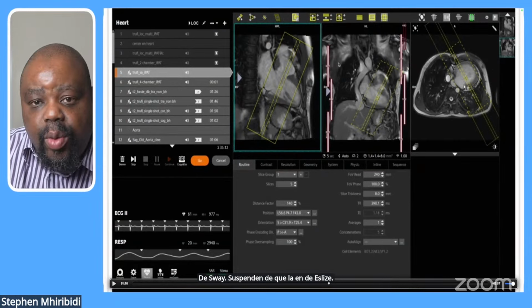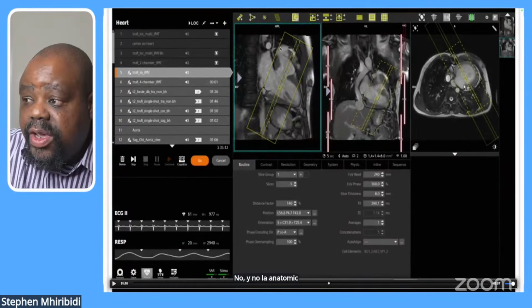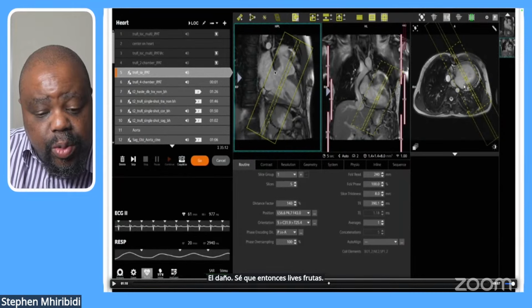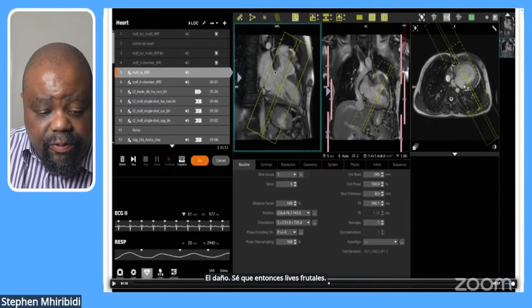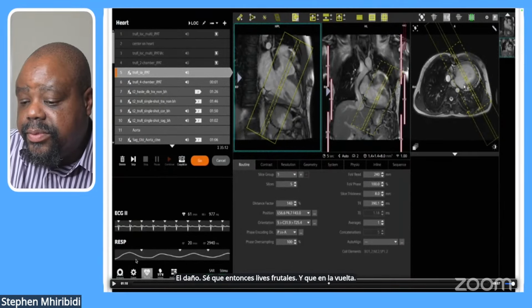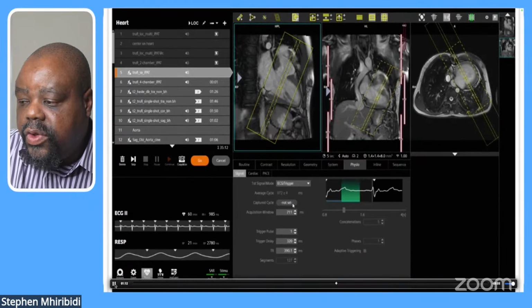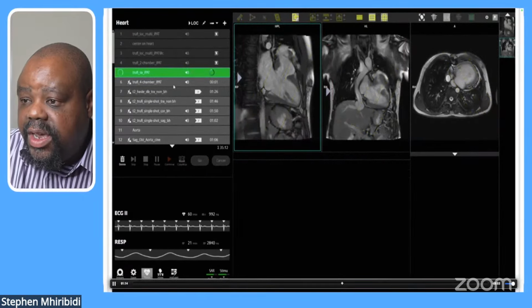Now, in normal anatomy, the idea is to have your first slice going through your atrial appendage, and then your second or third slice through the outflow tract. That way, when you plan your 4-chamber, you can avoid the outflow tract. So again, we capture slice and we proceed.